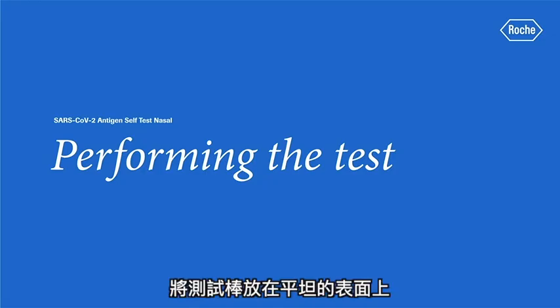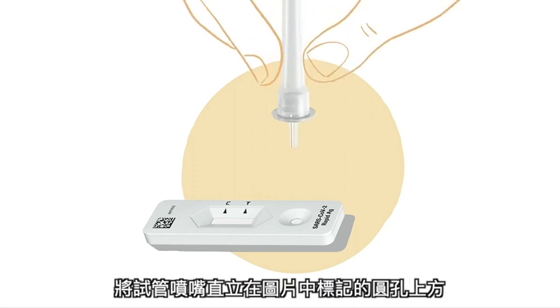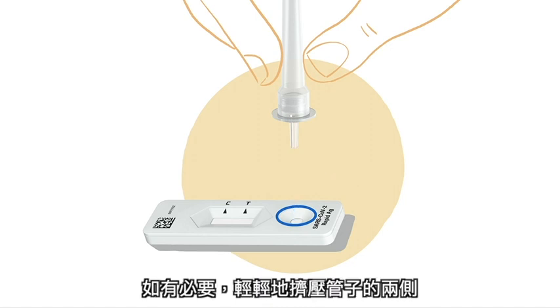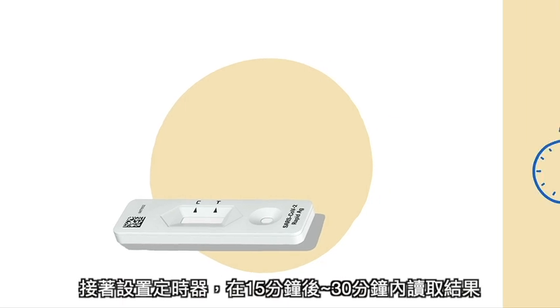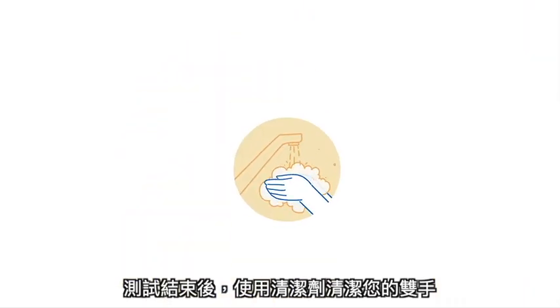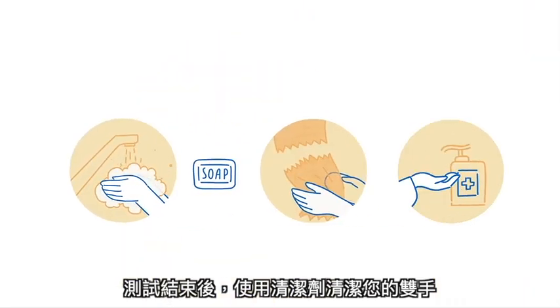Performing the test. Place the test device on a flat surface. Hold the tube upright above the circular well — this is where you drop exactly 4 drops of liquid. Gently squeeze the sides of the tube if necessary. Note that the test will still work even if you accidentally drop 5 drops onto the well. Set the timer and read the test results after 15 minutes and before 30 minutes have passed. Wash your hands with soap and water or use hand sanitizer after performing the test.